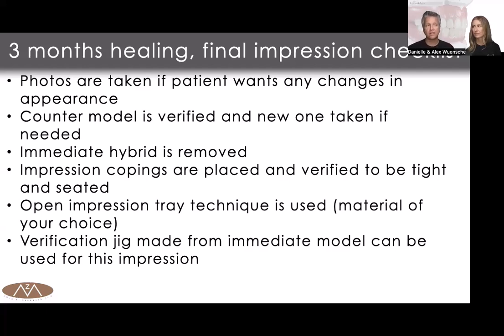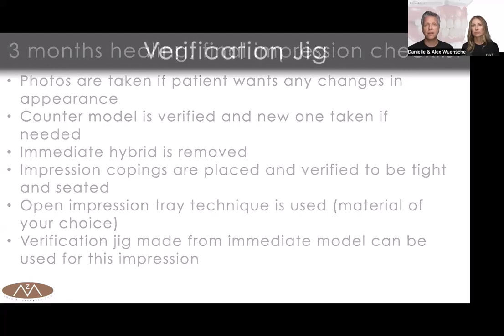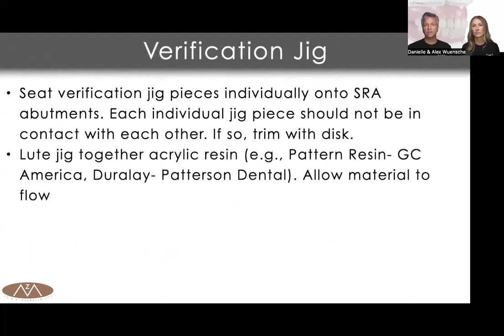And we explained in previous modules how we do that for implant restorations. So go back to module 3 or 4, I think module 3, where we go over digital dentures and how to take scans. So please go back, check it out, and be prepared. We're doing more on the digital side actually than analog impressions now.